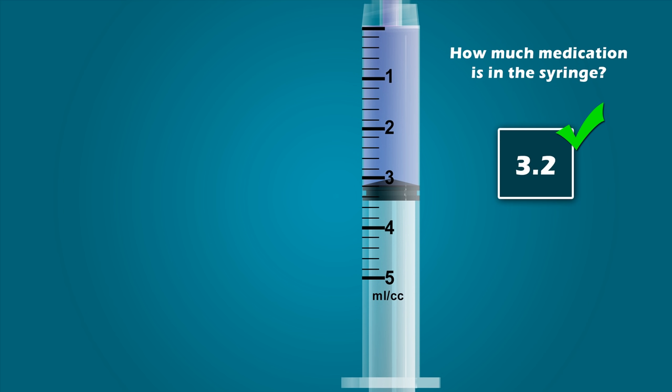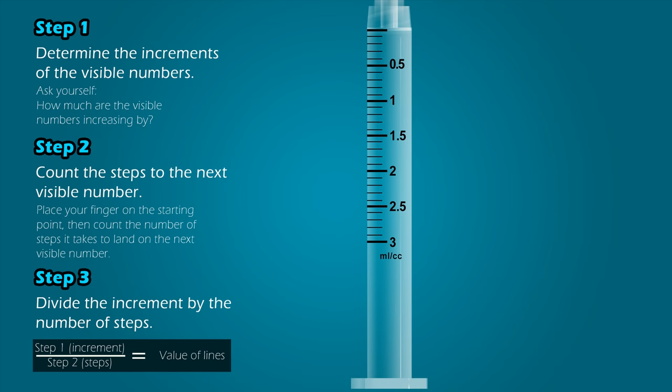Great job. Now that you are comfortable with reading a 5 milliliter syringe, we will use this three-step process to read the next few syringes. Let's apply the steps to reading this 3 milliliter syringe. Step 1: Determine the increments of the visible numbers. The visible numbers are 0.5, 1, 1.5, 2, and so on. That means the visible numbers are increasing in increments of 0.5.